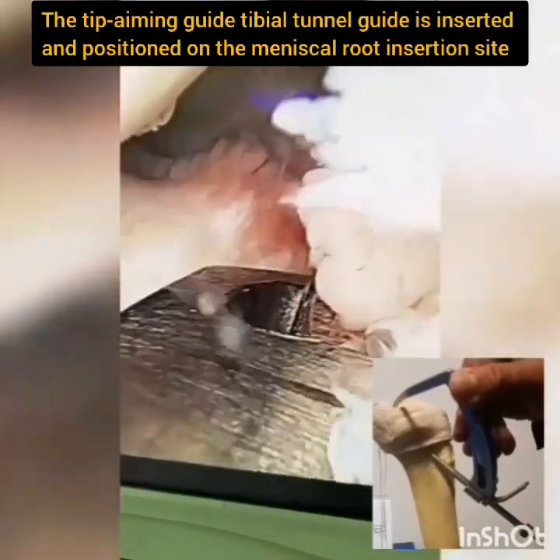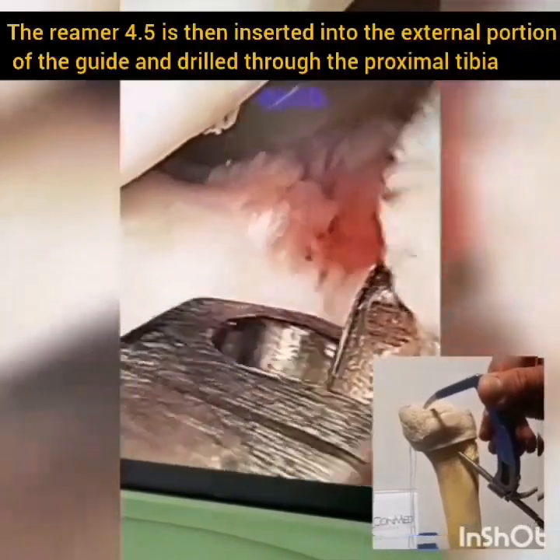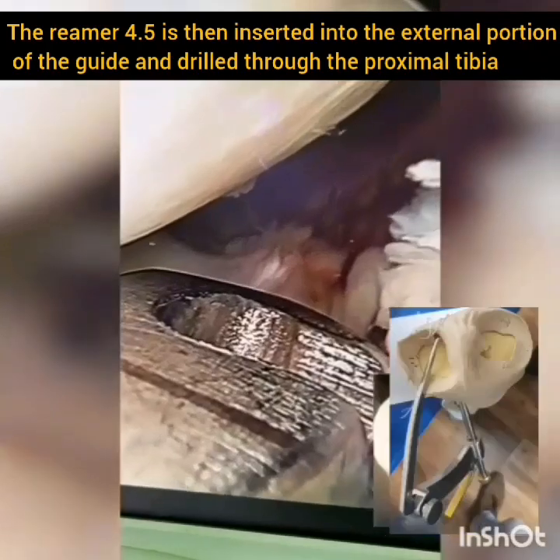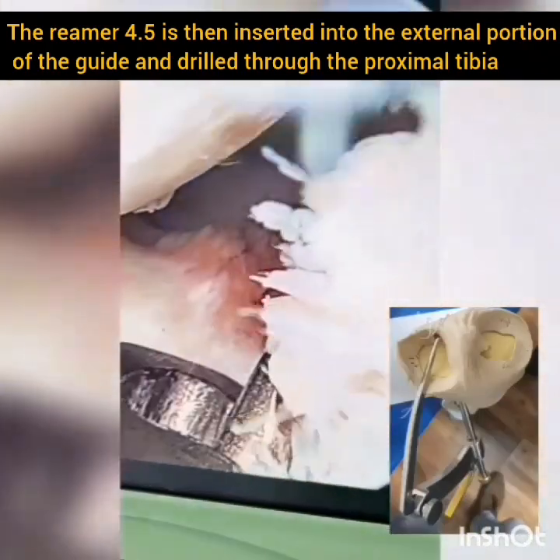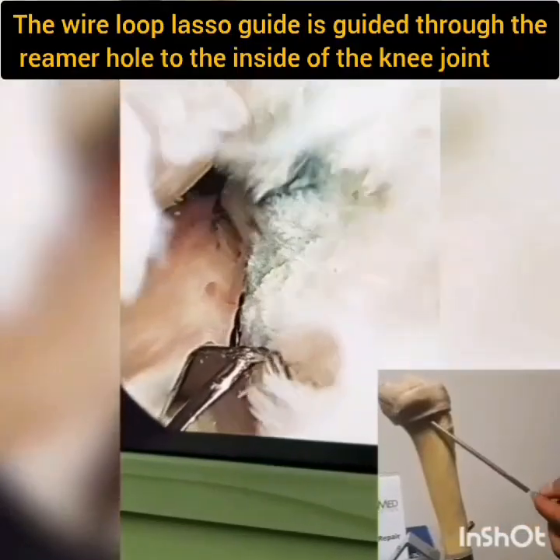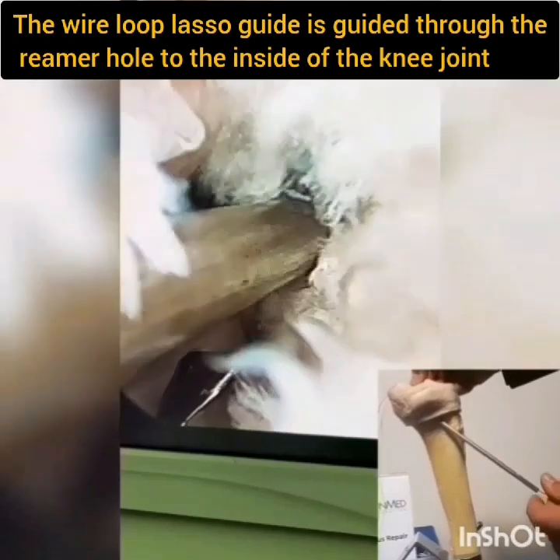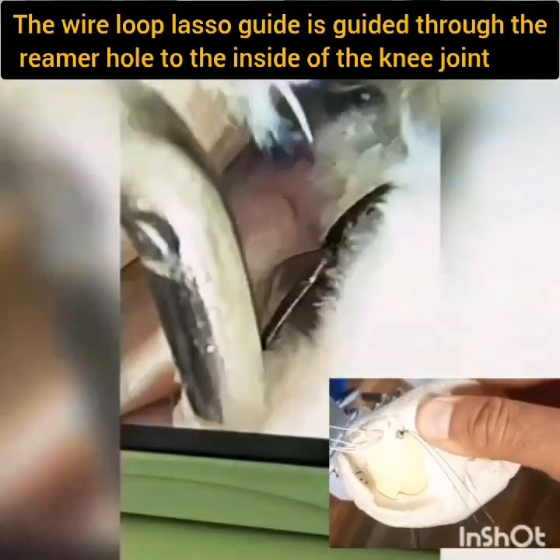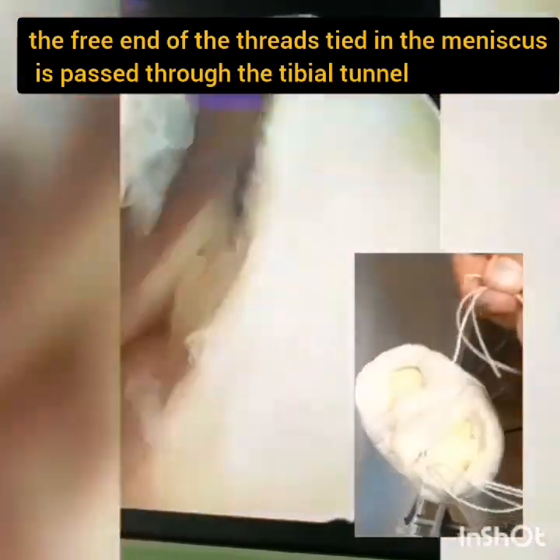The tip of the aiming tibial tunnel guide is inserted and positioned on the meniscal root insertion site. The reamer is inserted into the external portion of the guide and drilled through the proximal tibia. While the reamer remains, the guide pin is removed from inside the reamer. The wire loop lasso guide is guided through the reamer hole to the inside of the knee joint, and with its help, the free end of the threads tied in the meniscus is passed through the tibial tunnel.